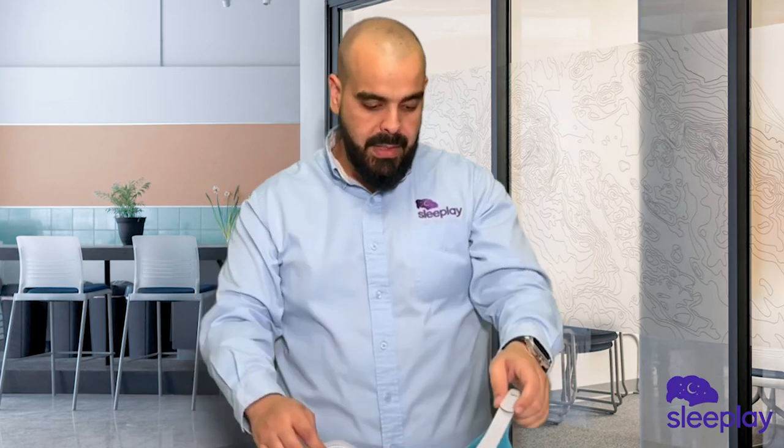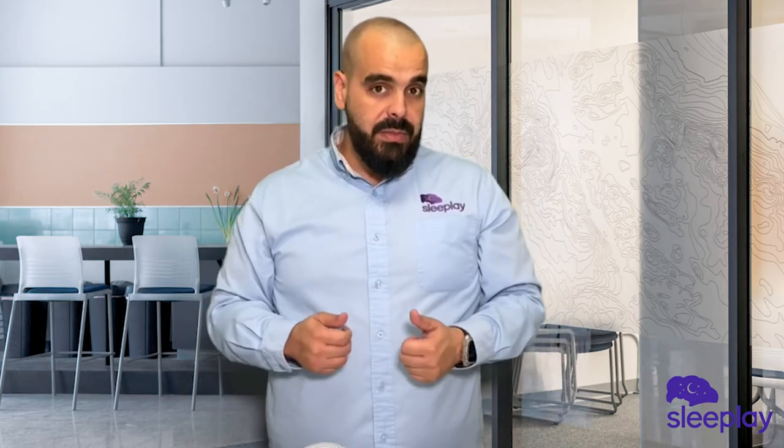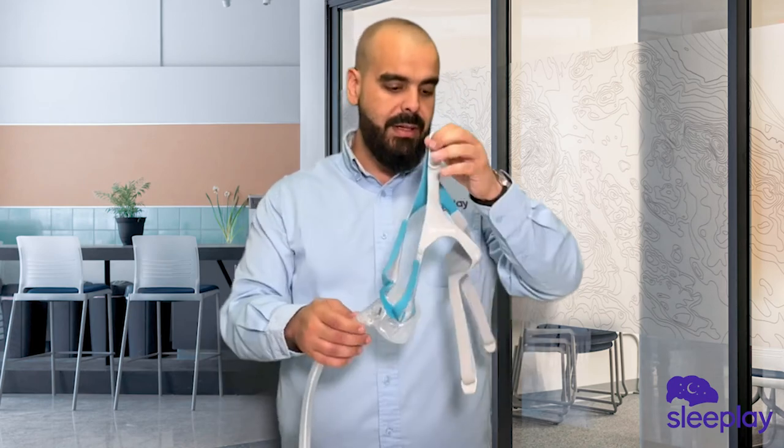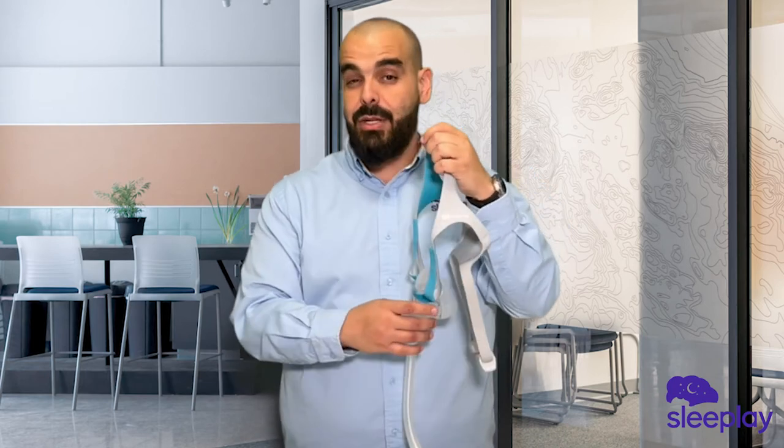Take a look at the Fisher & Paykel Evora mask. Do I give it two thumbs up? Yes I do — I give it two thumbs up because it's a great mask. It's great for the competition.